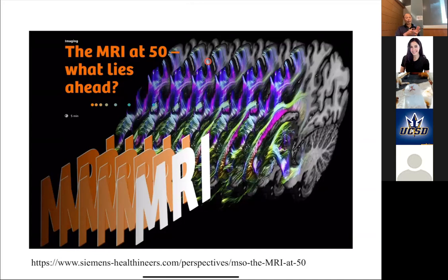You can just say, okay, I'm acquiring these k-space baselines, and anywhere I detect a lot of motion, I'm just not going to use that data, and I'm going to try to reacquire it at some other point in time. Okay, so there's a lot of different approaches.